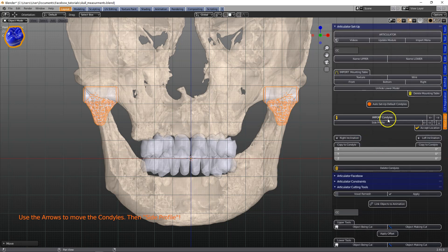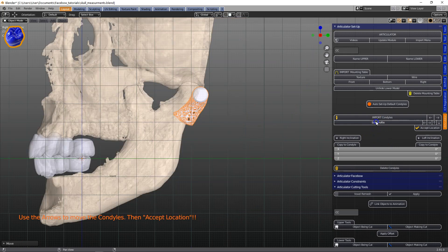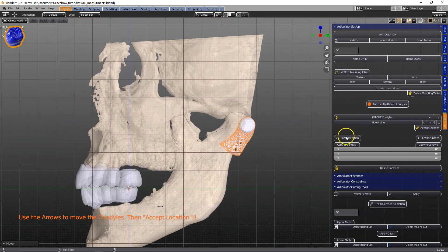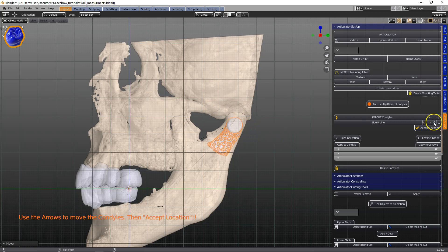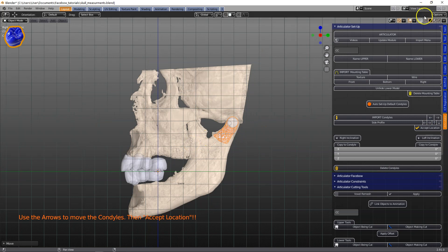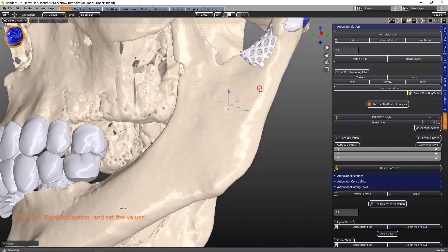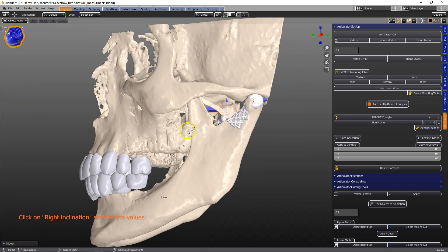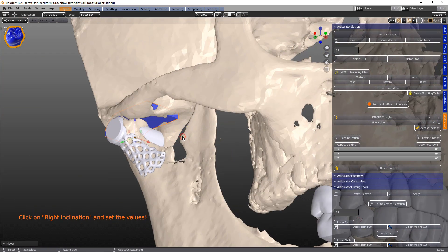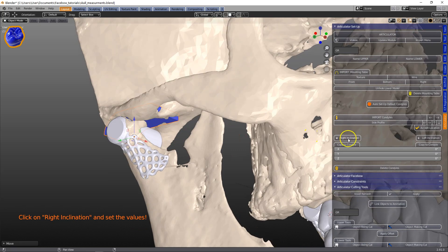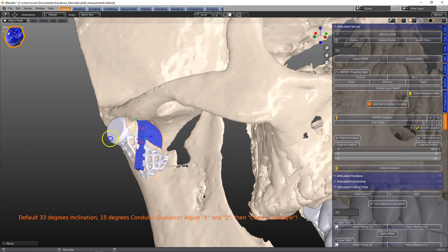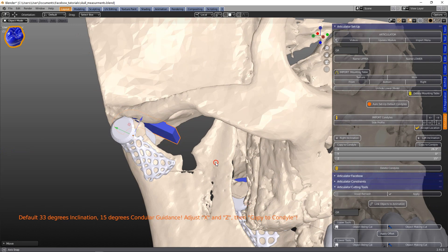Then we're going to look at it from the side view, and here exactly the same — using G has no effect, only the arrows can be used. Then we're going to accept these condyle position locations, and this will bring in these little blue guidance objects, and we're going to set these inclinations.